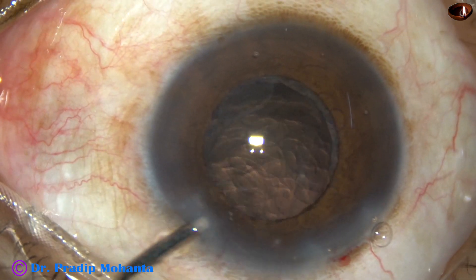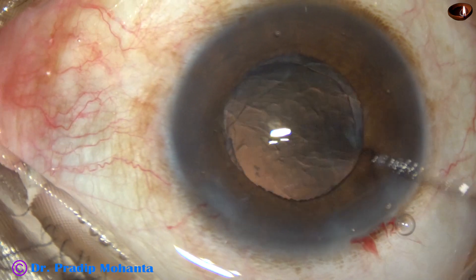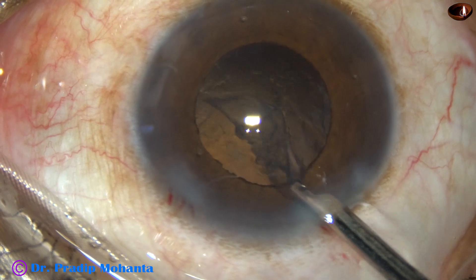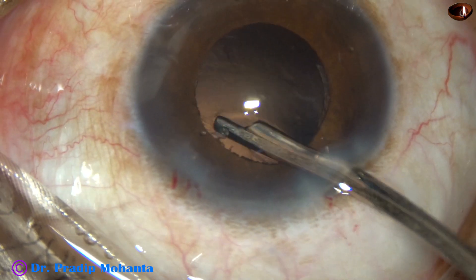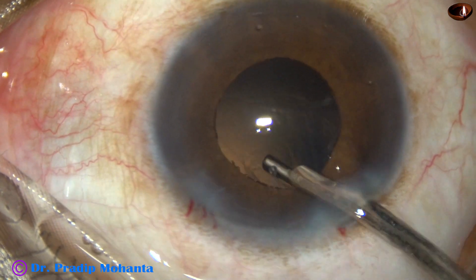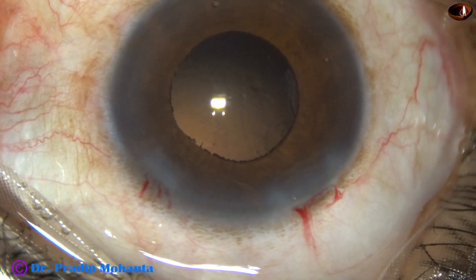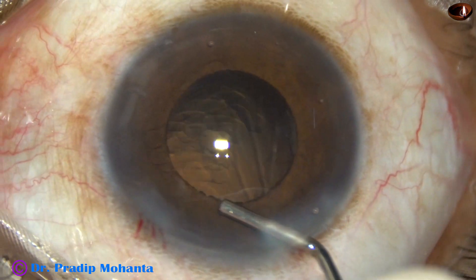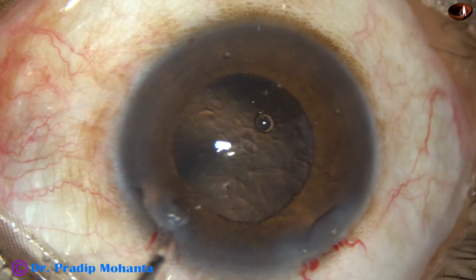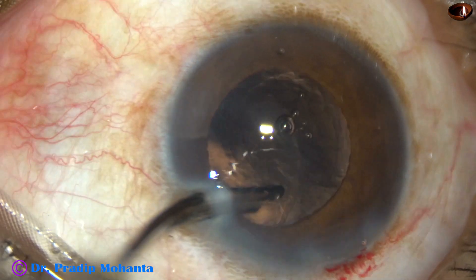Since there is only one side port, I am going to use a 23G Simcoe cannula for removal of cortical matter. This Simcoe cannula is attached to a 10 cc glass syringe. I can create high vacuum and the next moment very low or zero vacuum with my left hand, and the response time is much less than the response time of bimanual. So this is a safe instrument for cortical cleanup.